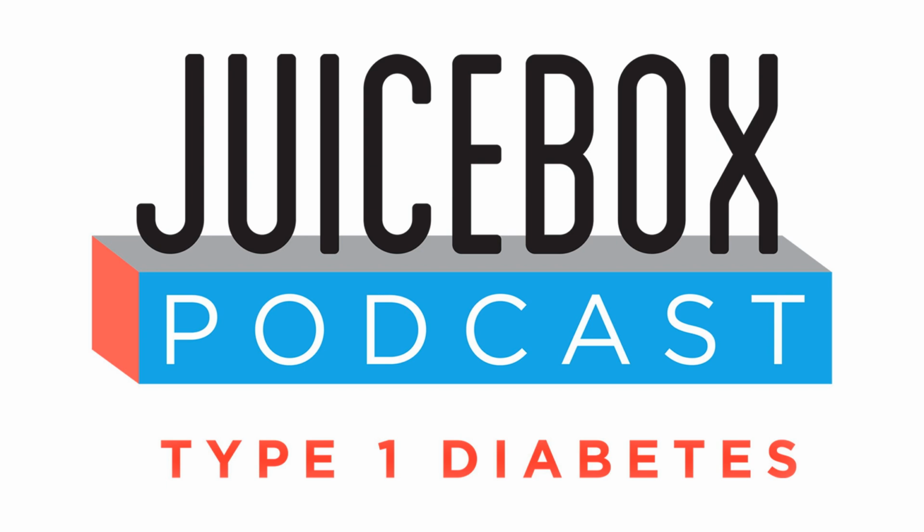But the other really great thing that is a big difference between it and the only other pod, there is a bolus button on the Mobi device. So if you do not have your phone, which drives the typical delivery and boluses and whatever else you're going to do with it, right, the bolus button right on the Mobi allows you to have a preset amount that gets delivered with the tap of that button. And it offers you the ability to also see that the delivery has gone through with vibration, which is nice. It's just a confirmatory, hey, this definitely worked. It went through. You don't have to worry.